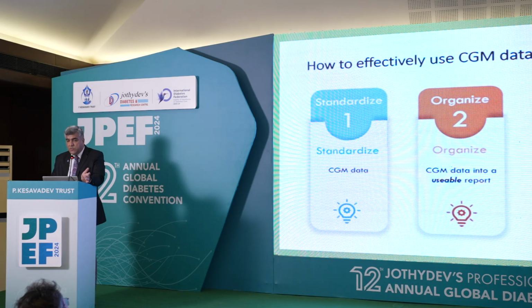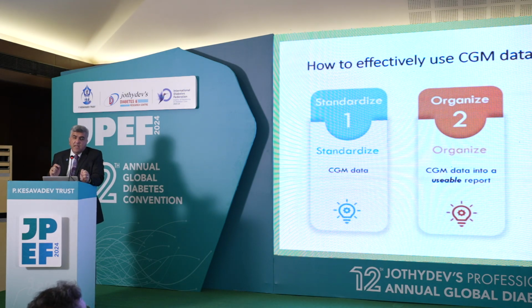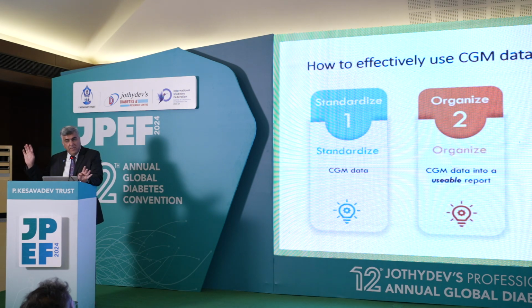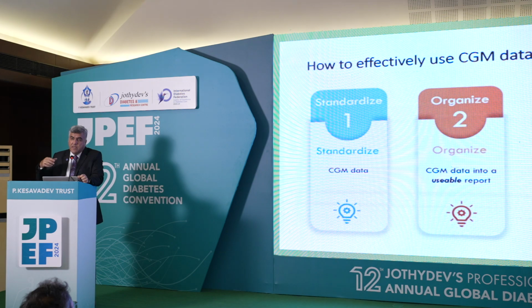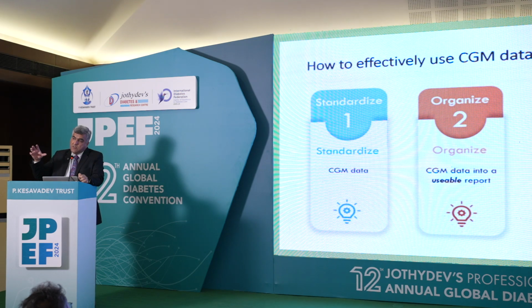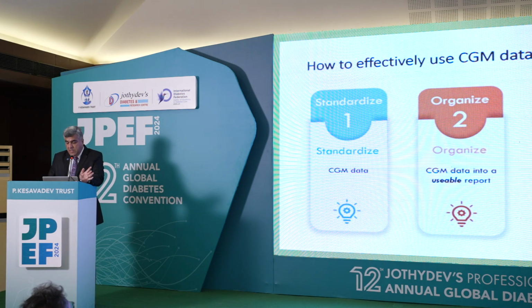So how to effectively use the CGM data is by AGP. As I said, AGP is not owned by ADC or the Libre makers. It's a software licensed from IDC, Minnesota. Anybody can pay the money and take this software, for any company's product. So today a lot of other CGM companies are licensing this product and using that software to apply to their data.